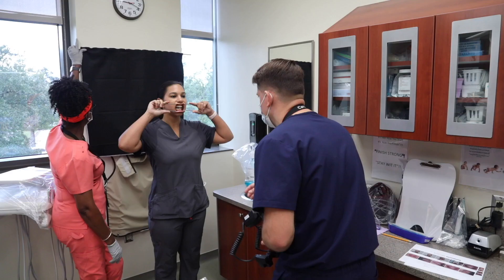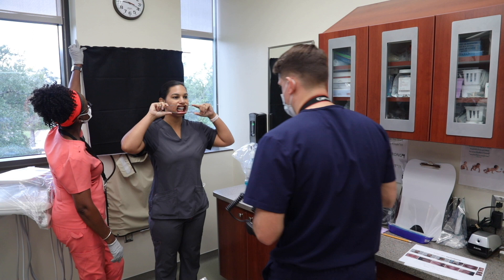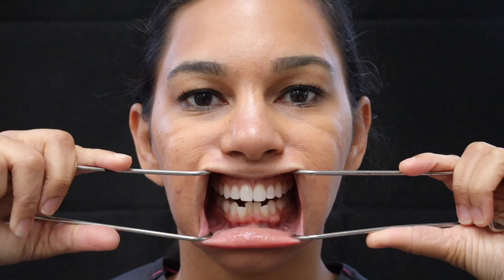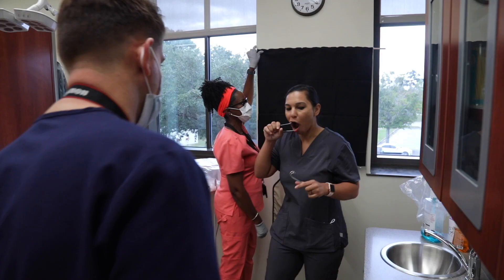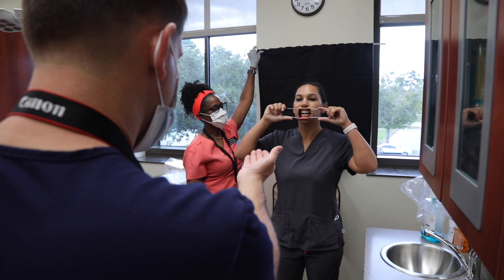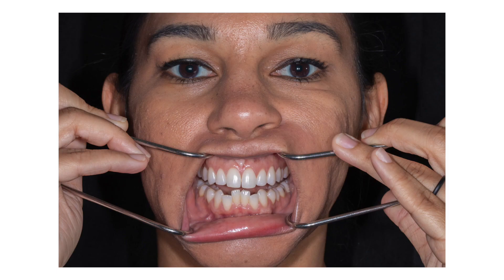You can shoot this image with the patient standing or sitting — I typically shoot this while the patient is standing. The patient is positioned directly in front of me. The most important parts of this photo are the eyes and the teeth. The patient will likely need some help if they have never used retractors before. Here we are using metal retractors: the big side goes in the mouth and the small side is the part the patient holds. The mouth is retracted and the teeth are slightly apart. I try to orient this photo so the interpupillary line is parallel to the horizon, and I will focus on the eye.